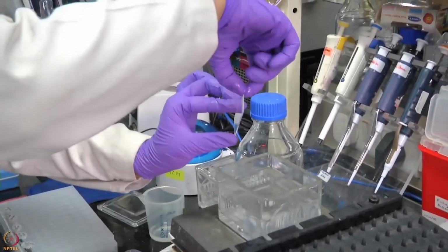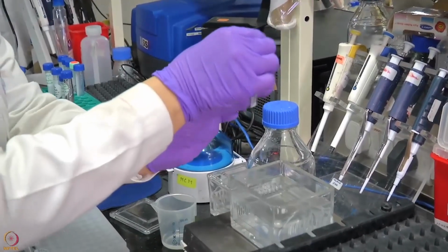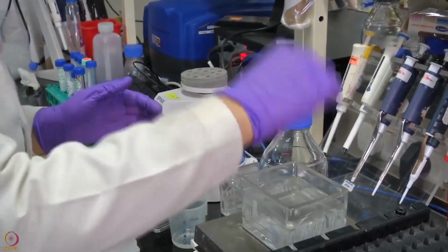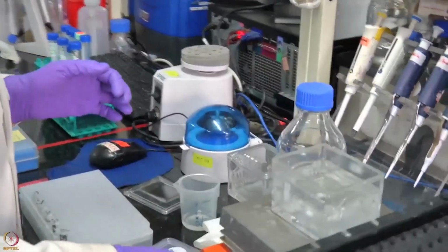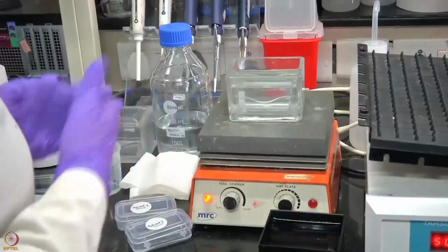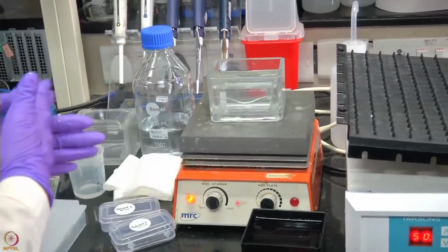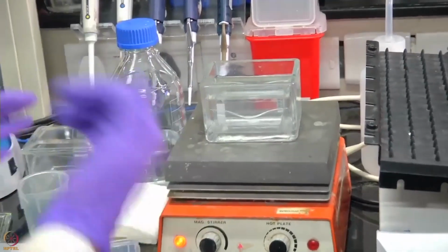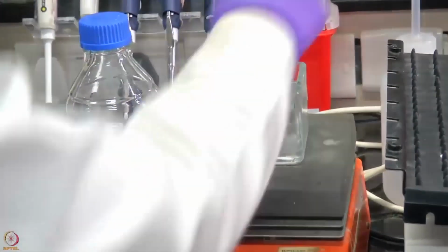The same is repeated for the other slide. Touch the slide at the corners and place it back into the buffer. And now we start the washing again. So this is done thrice so that all the extra blocking reagent is removed and the proteins are now available for the primary antibody incubation.